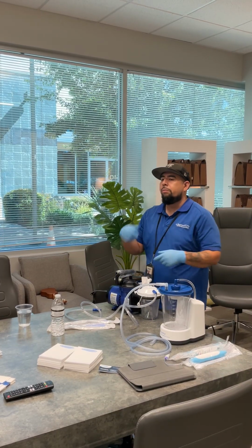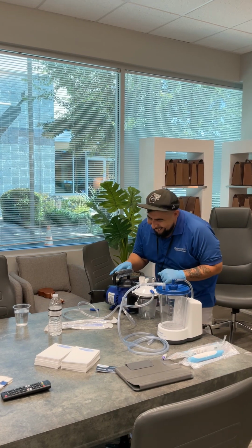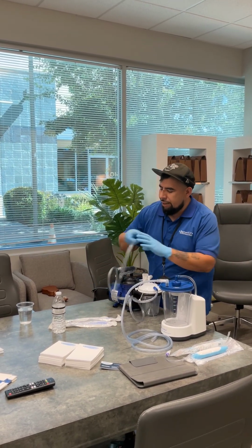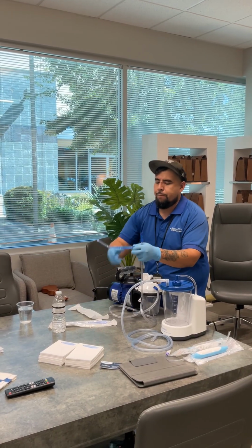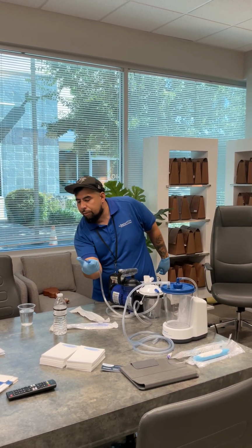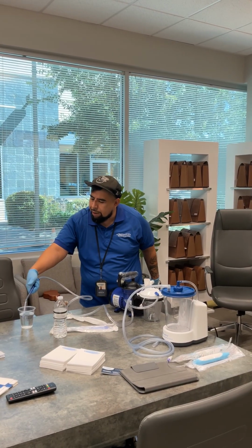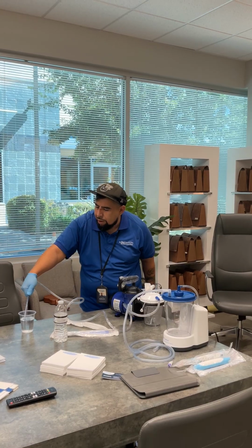Alright, with that being said, once we have this hooked up and attached to one of these suction wands right here, the most important thing is that we're paying attention to this vent. If we turn it on and try to use it without the vent being covered, nothing happens. The moment we cover it, it'll start removing liquid.